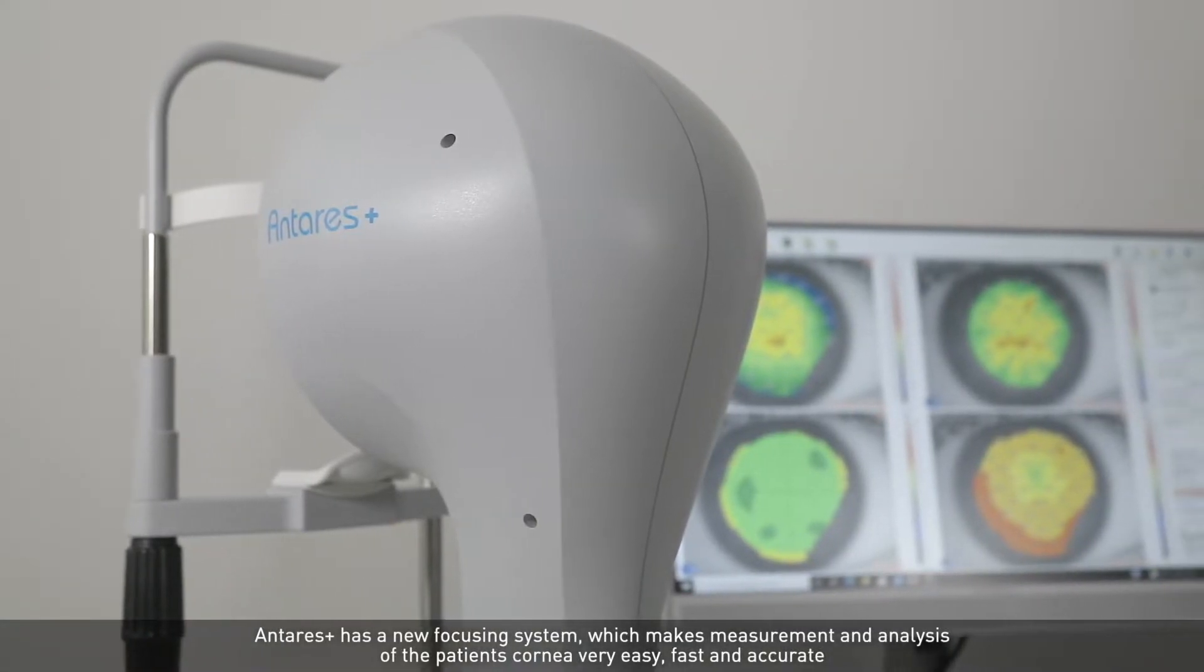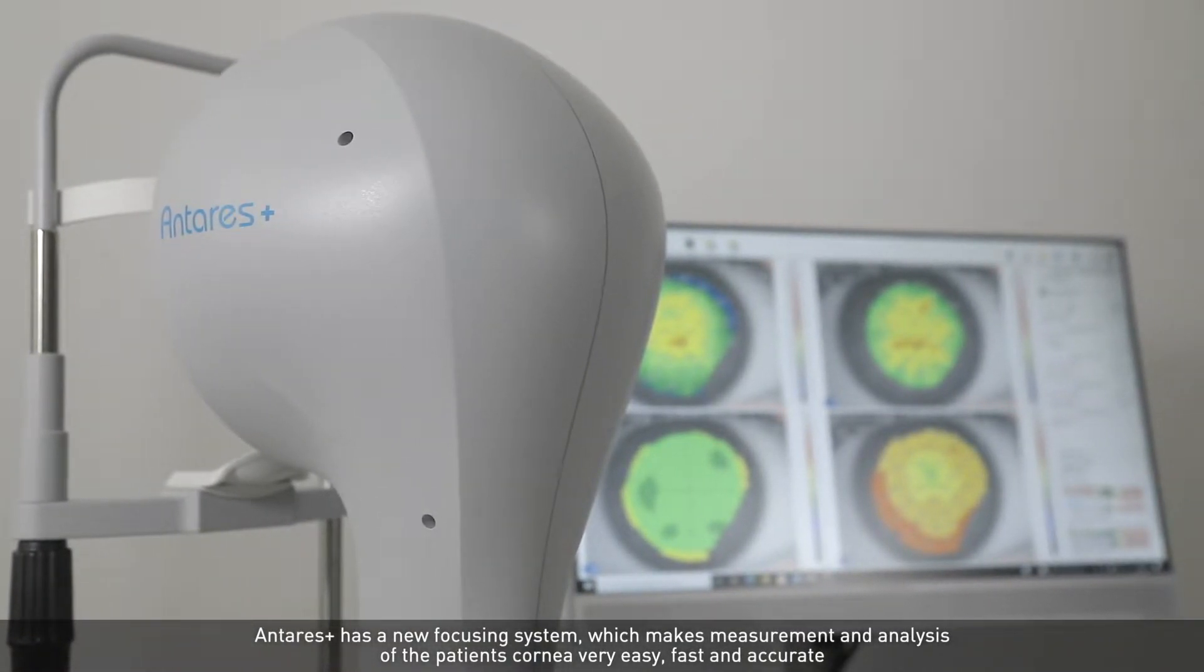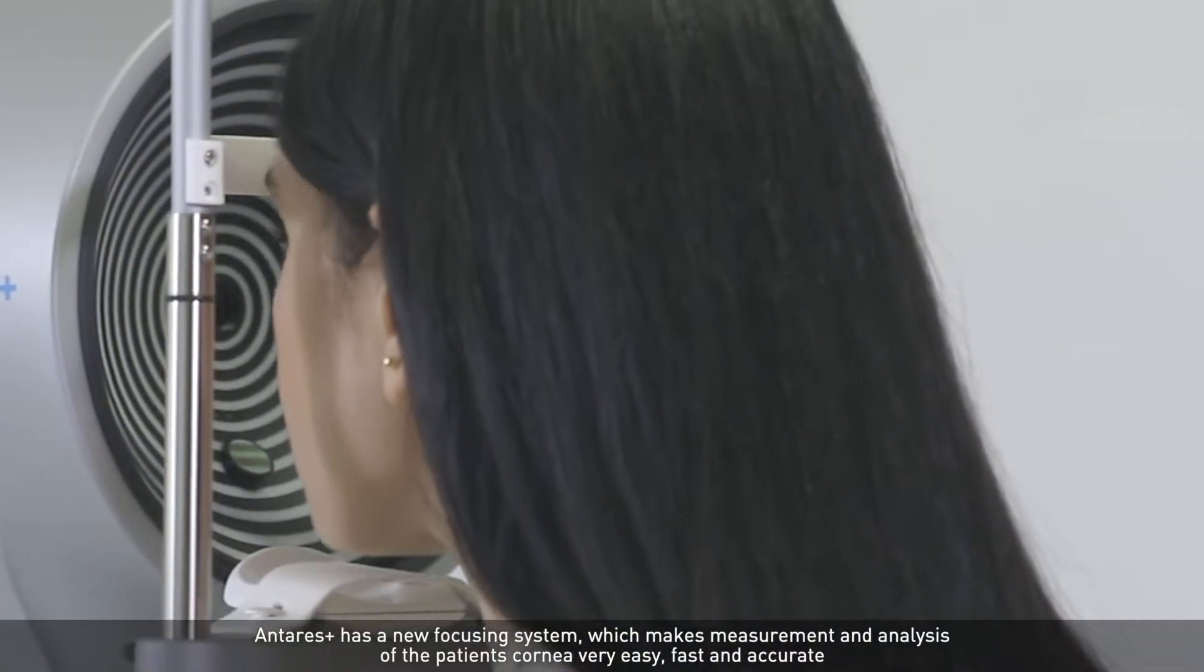Antiris Plus has a new focusing system which makes measurement and analysis of the patient's cornea very easy, fast and accurate.